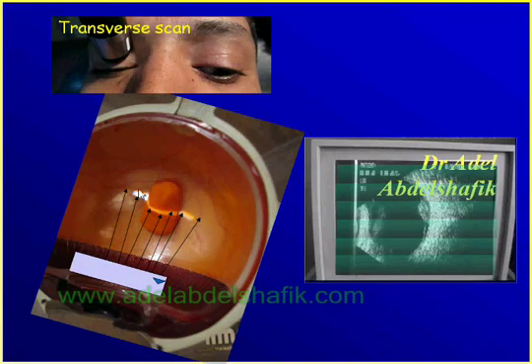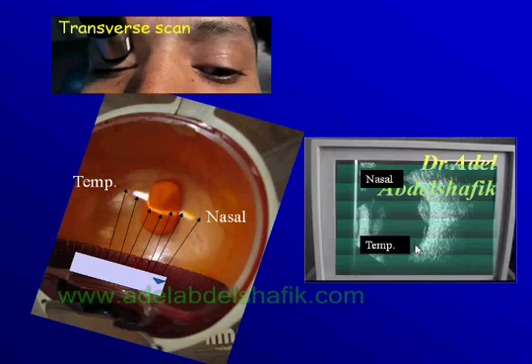So if you get this lesion, this tumor, here I am on the nasal. This is the nasal. And then the elevation, and here this is the temporal. So in this position, I'm getting information about the lateral extension of the lesion. How many hours does it extend? Say from 4 o'clock to 8 o'clock.